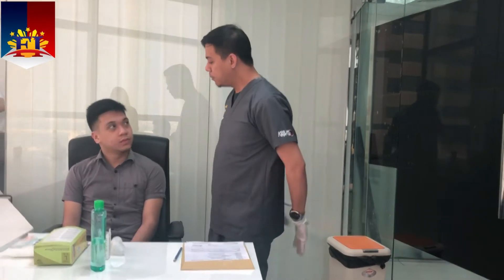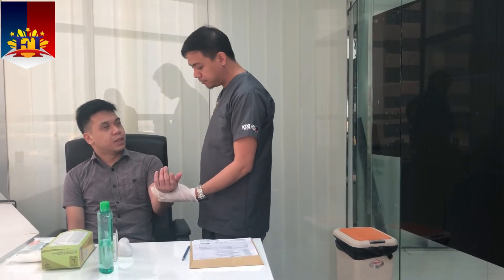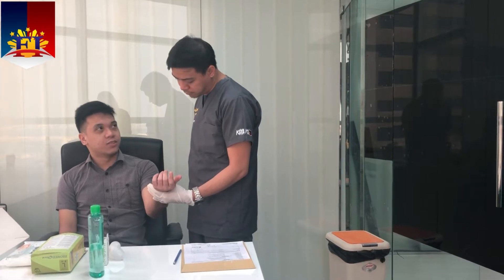Identify the patient. Good morning, sir. I am Robbie. I will be your caregiver for today. Can you please confirm your name and your date of birth? My name is Ritz and my date of birth is November 25th. Perfect, thank you so much, sir.